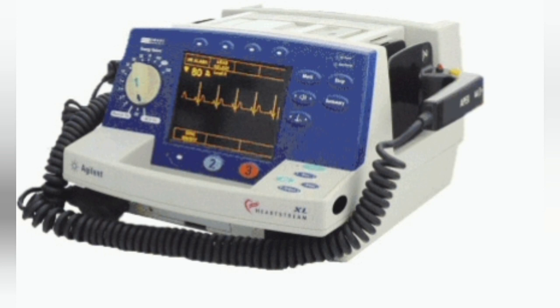Then the most important thing as far as the defibrillator is concerned is the design aspect. The main component used in a defibrillator is the capacitor, the hot component we can say. It is a very important component because it carries the charge and discharges the current.